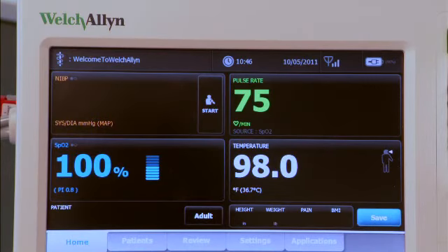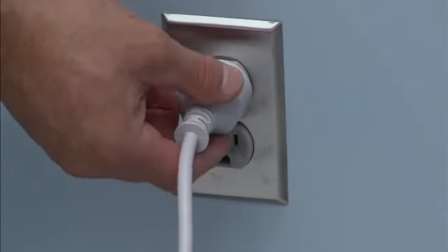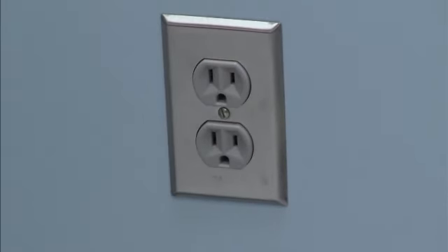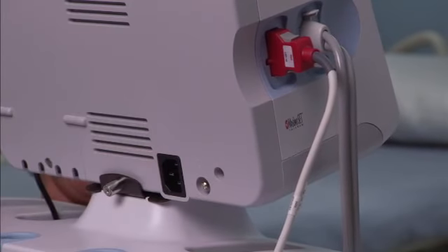To power down your monitor and detach the accessories, follow these steps. Touch the battery or plug-in icon in the upper right-hand corner. Touch power down. To disconnect the AC power, disconnect the power plug from the outlet. You may also disconnect the power cord from the AC power connector port on the back of the monitor if you like.